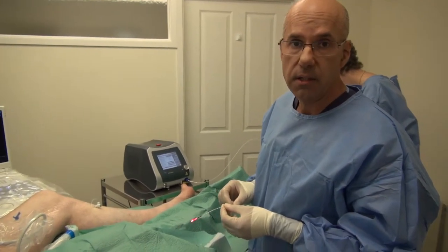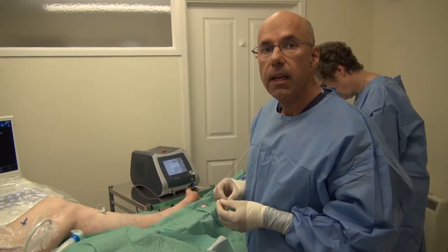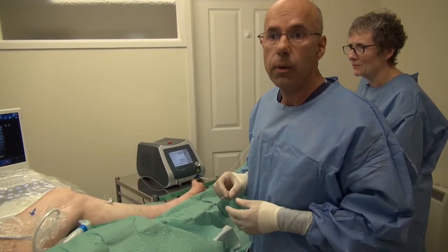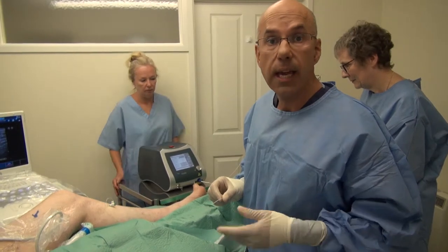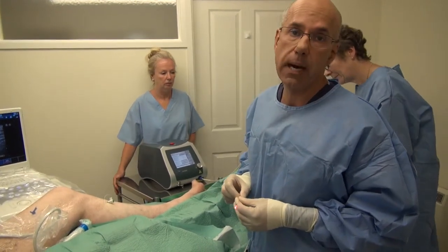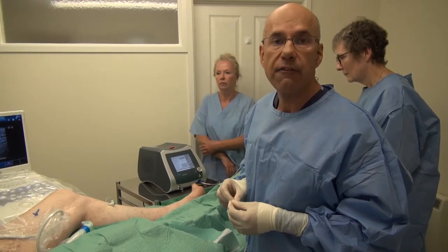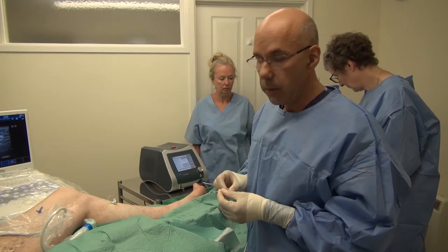It's the state of the art system which has a 1470 nanometre wavelength. This has a number of advantages. It's specific for water, which is the main constituent of the vein wall, so that energy is selectively absorbed by the vein, which means that it's much more comfortable and the recovery is very, very straightforward with very little discomfort.